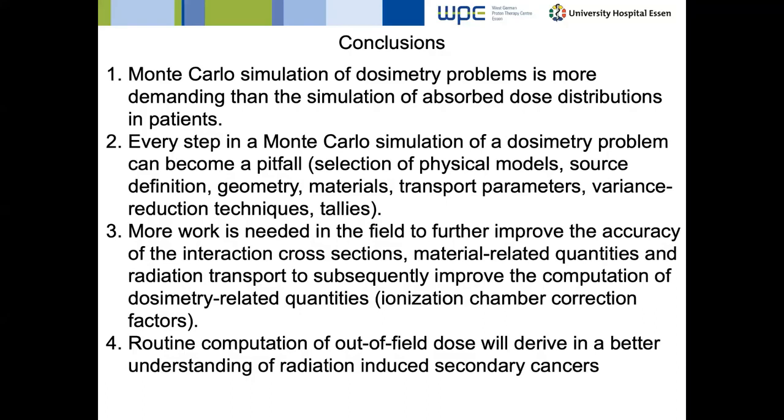So if everyone lets me, I will start with the questions from our audience. Dayananda from Chennai is asking, which Monte Carlo code do you recommend for the most accurate modeling in clinical proton beam energy? Currently, I would say Geant4 with a wrapper specifically addressed for radiotherapy problems such as TOPAS. That's what we use. FLUKA also gives excellent results. And there is also a wrapper called FLAIR.